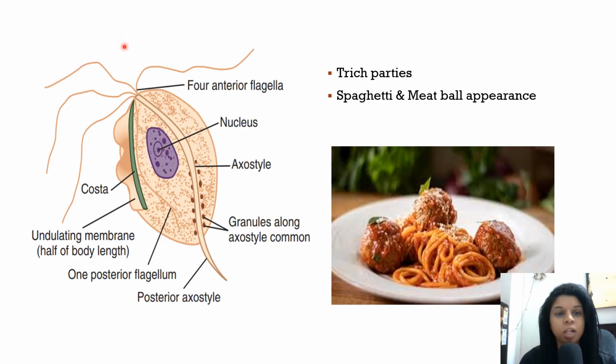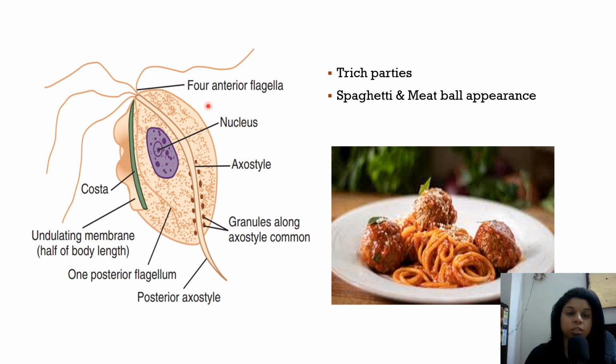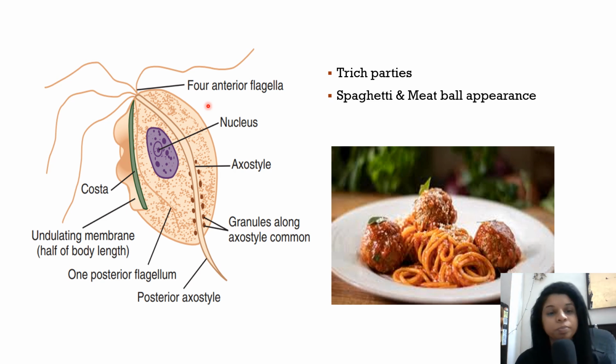So you should find which is the feature you catch up very fast. And then it is a very common exam slide. If people tend to keep a pap smear in for examination, you should check that trichomonas is there, because for many examiners it is a favorite slide, and other parasites also especially.